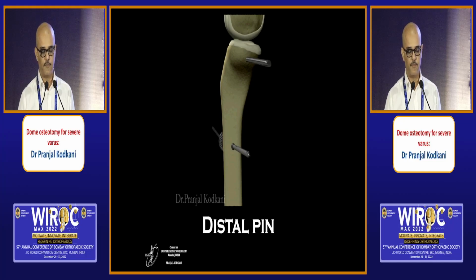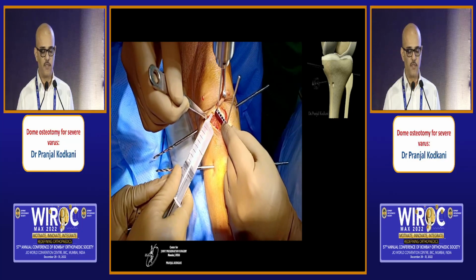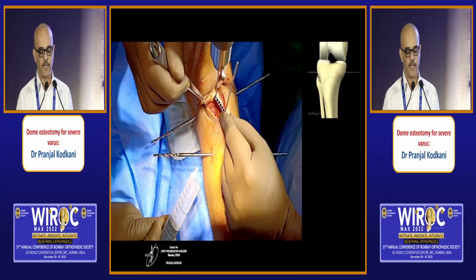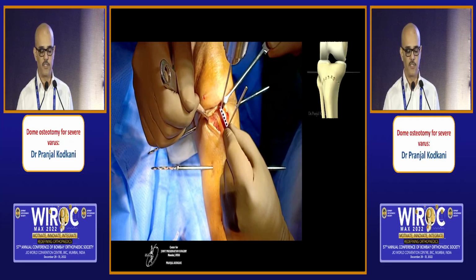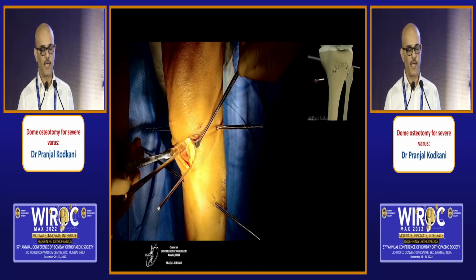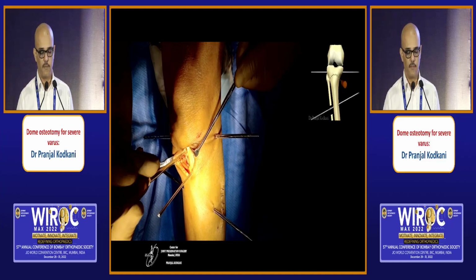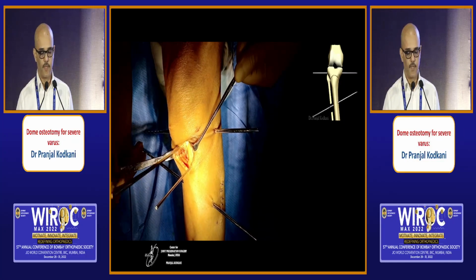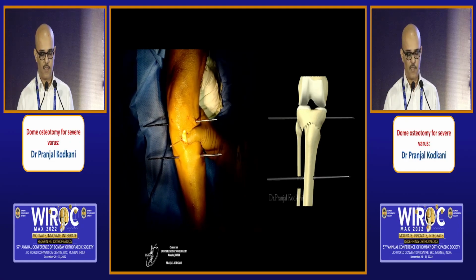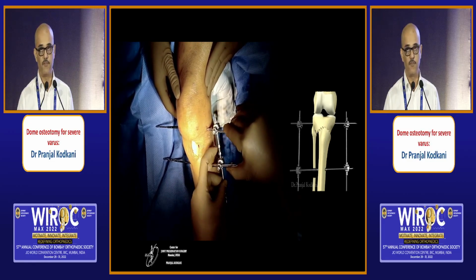The distal pin is then passed at the angle of predetermined correction, what we've done in the preoperative planning, to the proximal pin. The midline incision, proximal end of tibia exposed, and using this simple device, we can make multiple drill holes in a dome-shaped fashion in an anteroposterior direction proximal to the tibial tuberosity. Once that is done, we use a narrow 5 millimeter osteotome and just unite these holes together to complete the entire osteotomy. Acute correction is then achieved on table till both the pins are parallel to each other, and we assume that the degree of correction we've planned for is achieved.